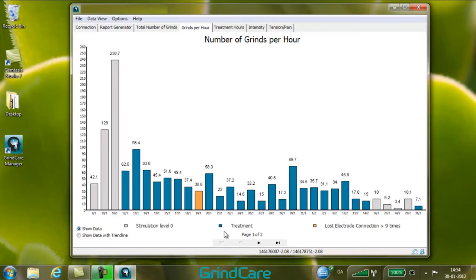The orange colour indicates that the electrode has lost contact to the skin more than nine times during the night. If this happens frequently, please check that the skin is cleaned and the electrode placed correctly before proceeding with further treatment.